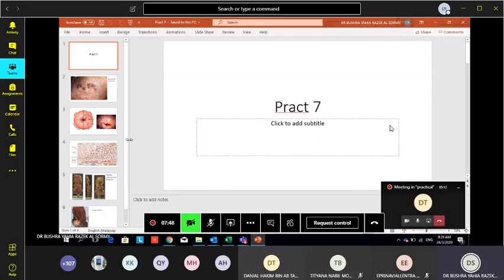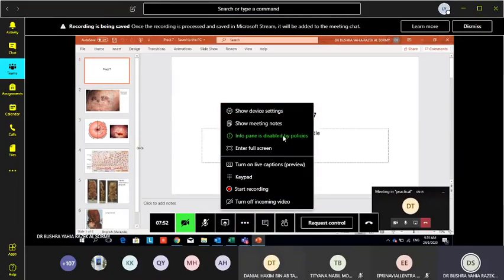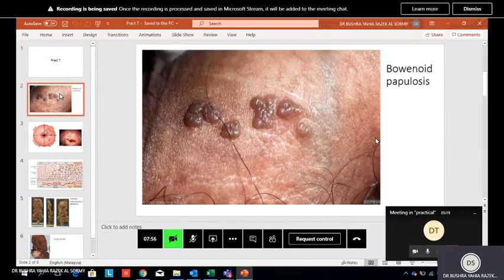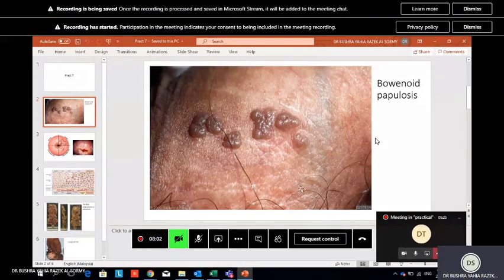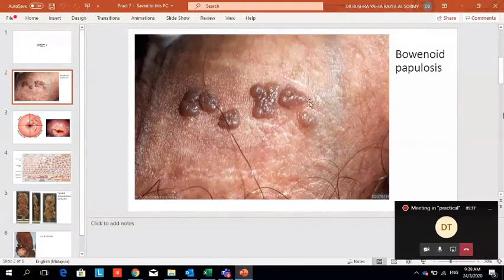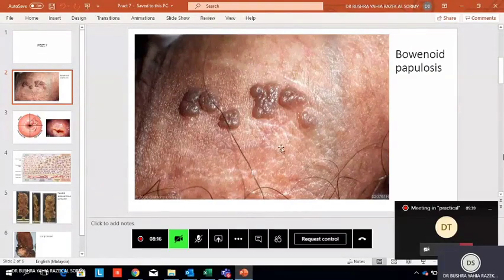Of the lesion, describe the cytological change. Okay, so actually we don't have the gross specimen, but I give this picture to see how the lesion usually looks. It's like a warty lesion. See, elevation from the skin shaft. This is the skin shaft of the penis.